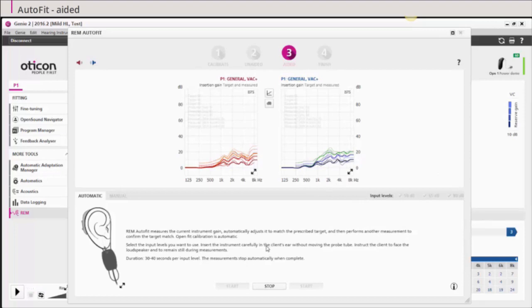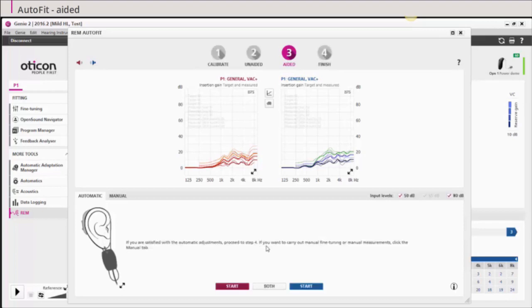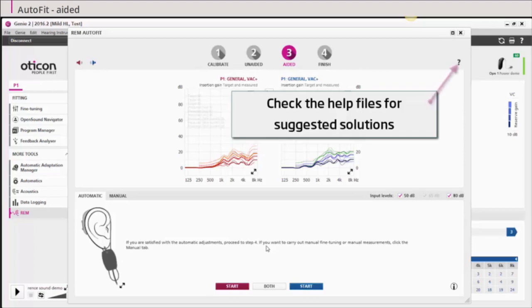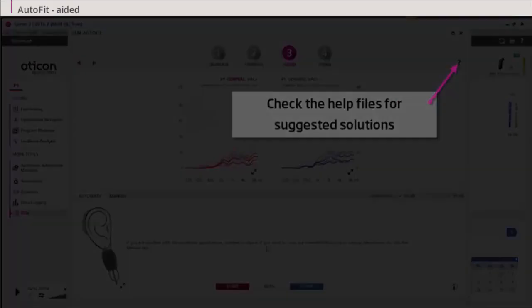If the target cannot be reached, please check that the selected hearing aid and acoustics are appropriate for the hearing loss and that the feedback limit is not limiting the gain prescription. If you can't reach target, check the help files for suggested solutions.